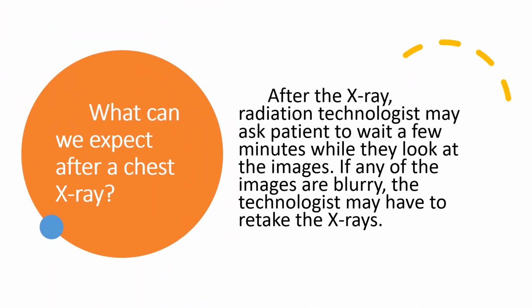So what we will expect after the chest X-ray. When we are getting clear images, we will send the patient back. If the images are blurry and not clear, we will retake the X-ray.